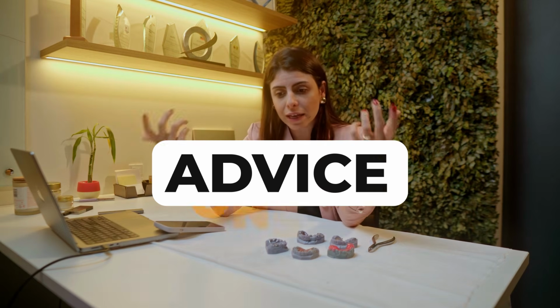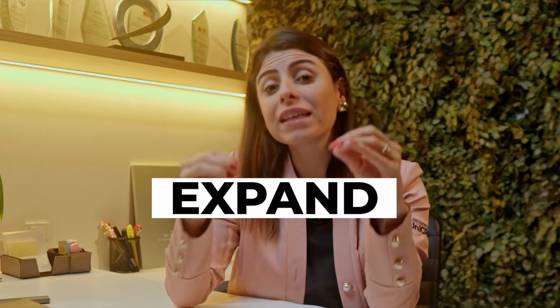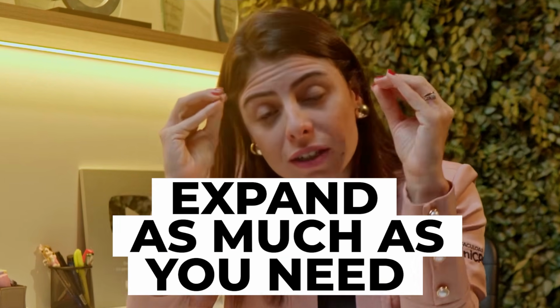And if you still don't have the expansion you need, here's a helpful tip for you. Number 1, don't use a rigid expansion protocol where you only activate for 10 days or only for 14 days. No, expand as much as you need, until you achieve complete overcorrection. If it takes 16 days or 18 days, do it, okay? So you don't run into the problem of feeling like you should have opened the screw more, but you didn't manage to.